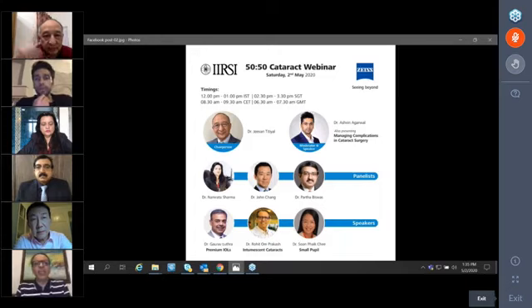Yeah, Deepak Magur has come out with a beautiful presentation. What he does with all these plaques is he takes a dissector and goes beneath the anterior capsule and tries to create a plane. And then he dissects it. He uses a bimanual forceps for that matter and holds it and just spears it.